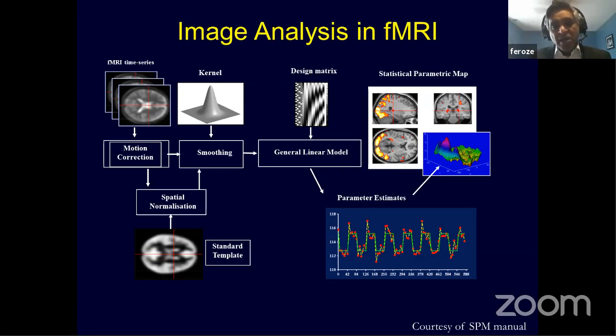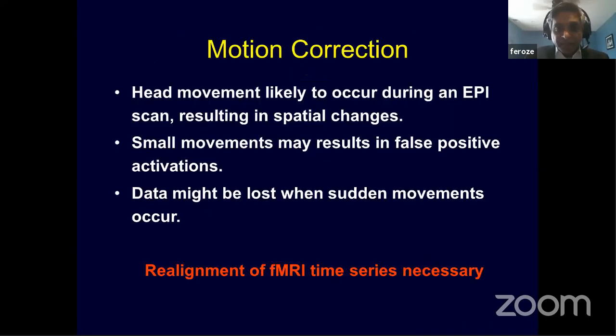But of course, there is also software which is more rigorous, implementing different methods for analysis as well. So once you do the pre-processing, the next step is statistics, because we have all come to know that statistics is very important, making sure that these signals are properly vetted.